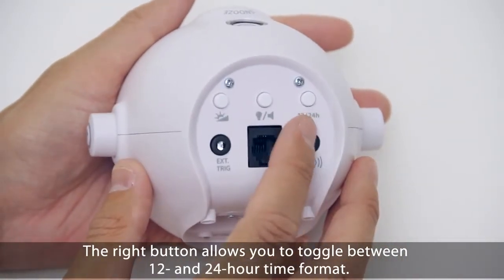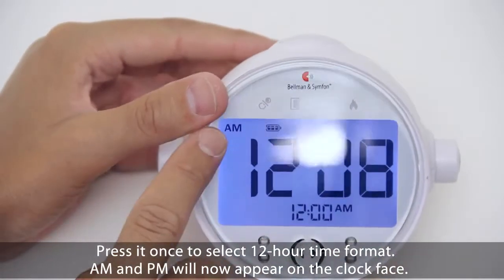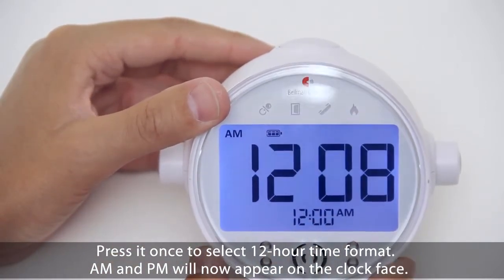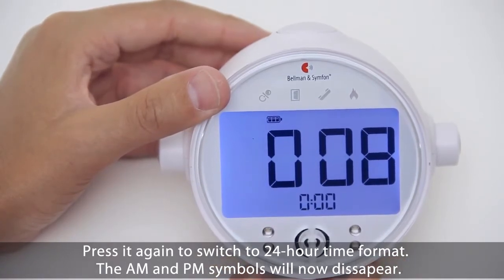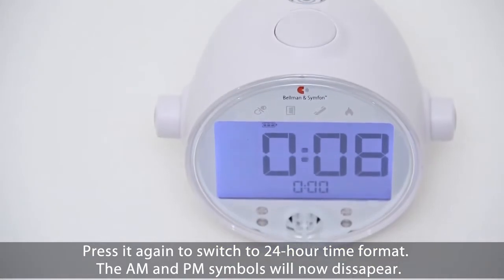The right button allows you to toggle between 12 and 24 hour time formats. Press it once to select 12 hour time format — AM and PM will now appear on the clock face. Press it again to switch to 24 hour time format and the AM and PM symbols will now disappear.